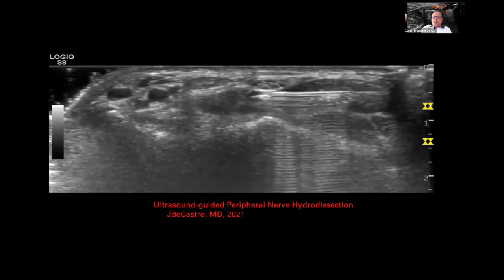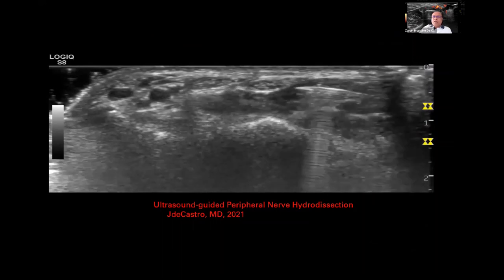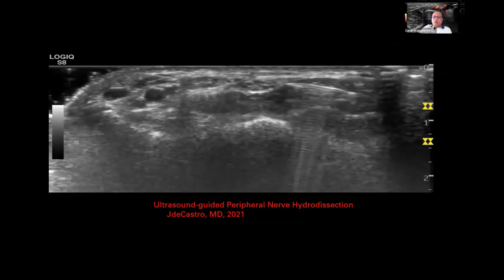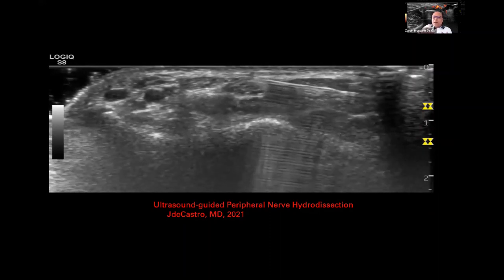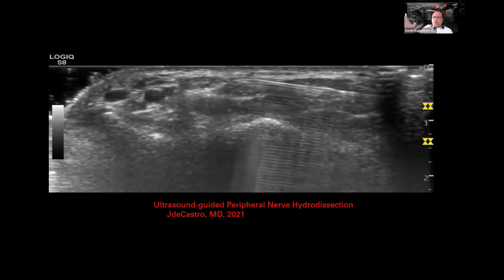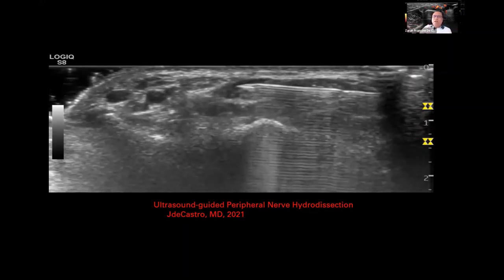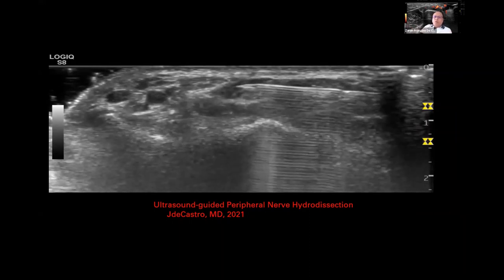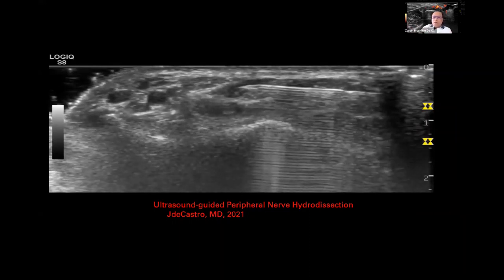This is an ultrasound-guided nerve intervention of the ulnar nerve. You can hydrodissect the area in order to separate the nerve from the surrounding tissues and see how it could benefit your patient.